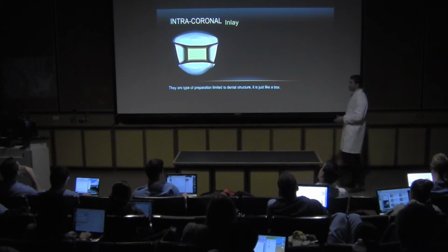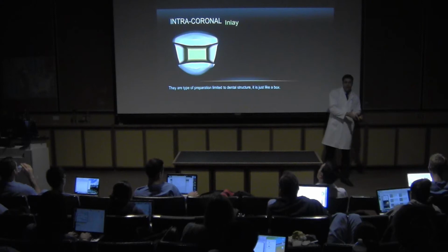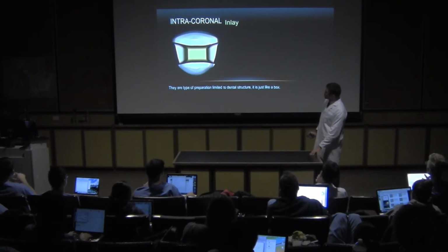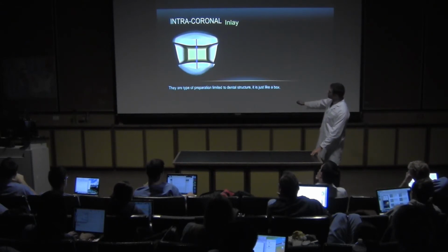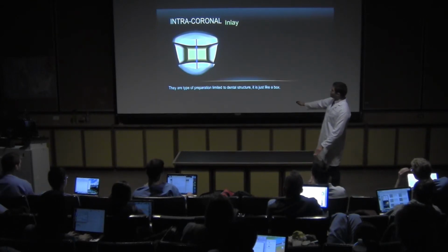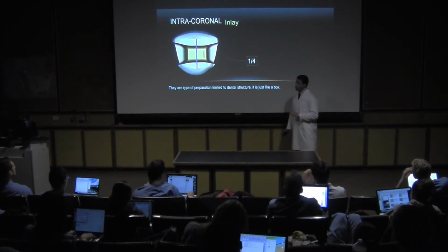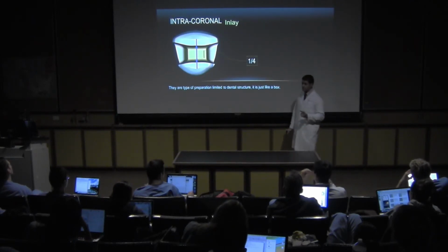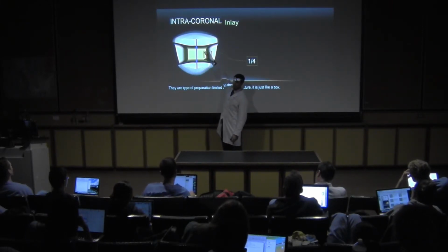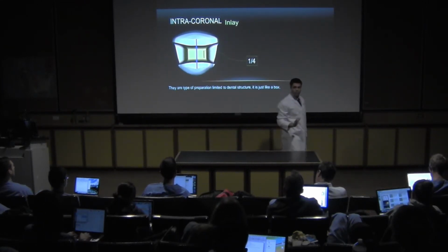And we can consider a borderline between a composite resin and an inlay restoration, thinking this way. Imagine here the intercusp distance. All right? So when we have 1/4 of the intercusp distance, our isthmus is going to be 1/4, we can work with composite resin, no problem.